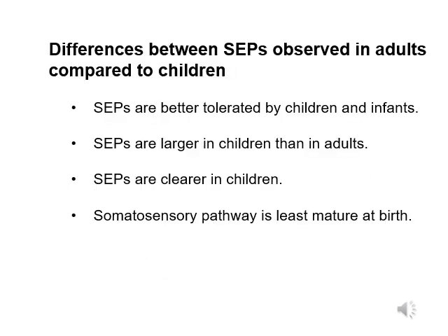A few last notes about the development of the SEP. SEP stimulation is generally better tolerated in children and infants than in adults, because the nerve fibers, which include the pain fibers, are not as well myelinated. Therefore, children are less likely to complain of pain or extreme discomfort during SEP stimulation.